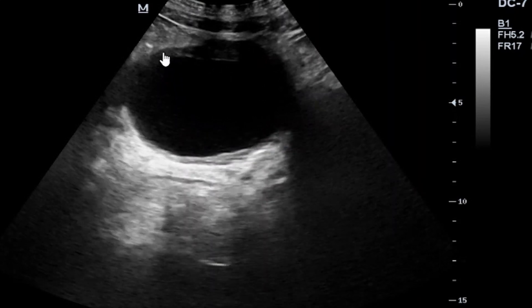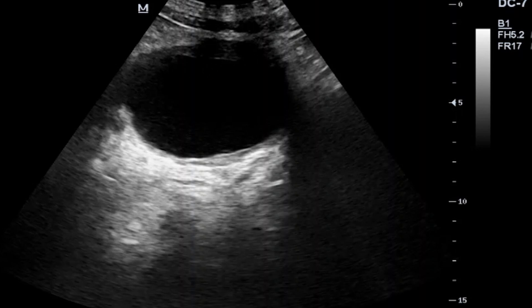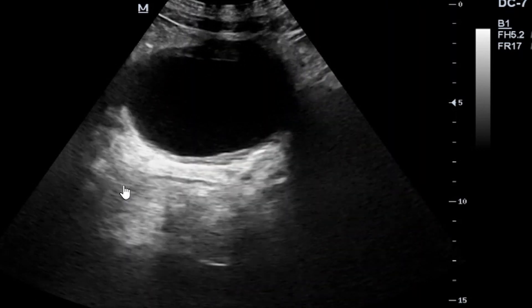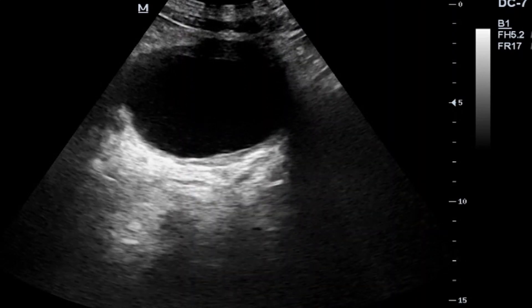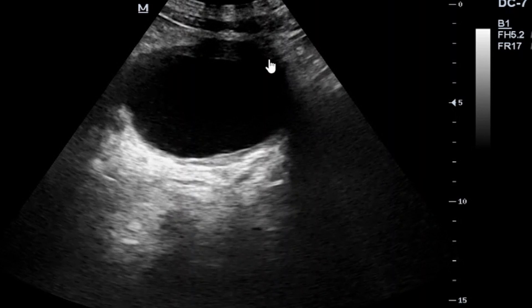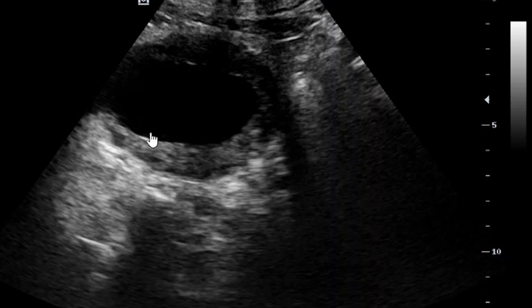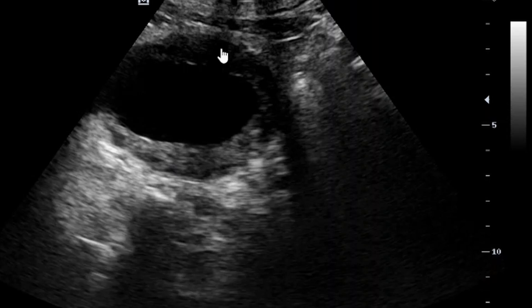Looking at this image, you can appreciate what I am talking about. When doing an ultrasound scan, it is important to look at and measure the thickness of the bladder walls. You can see that these walls are thickened, which is a sign of cystitis. The urine is not clear — it has some internal echoes. You can see the thickness on the posterior wall, the left lateral wall, the right lateral wall, and superiorly — the urinary bladder is concentrically thickened.